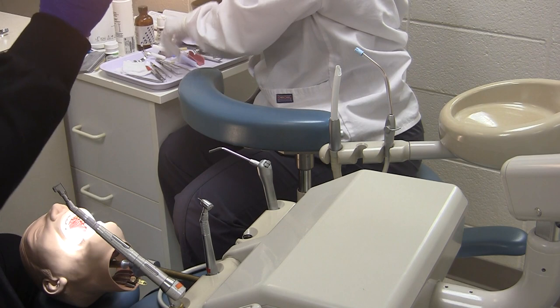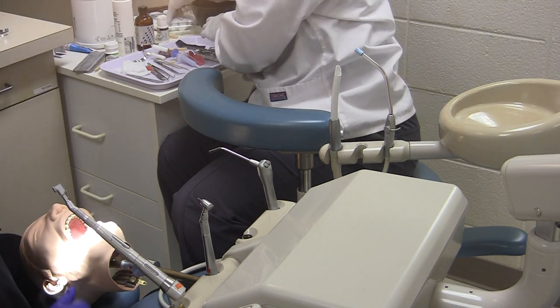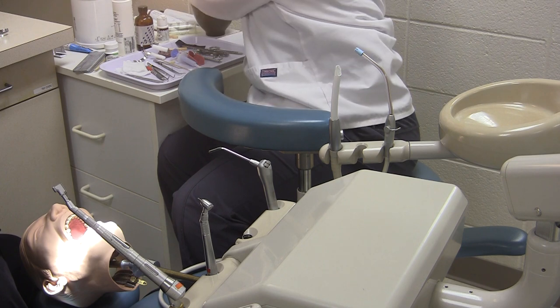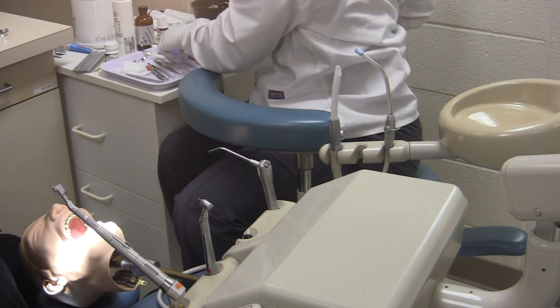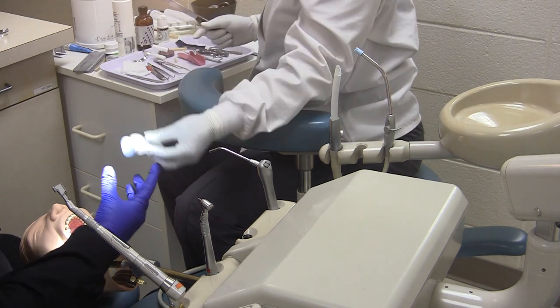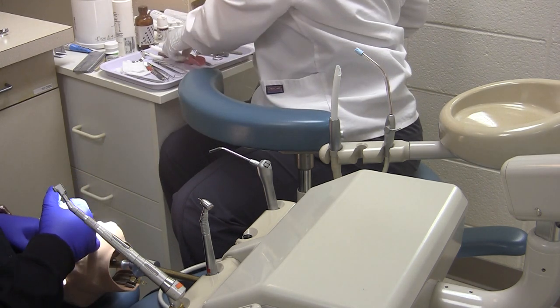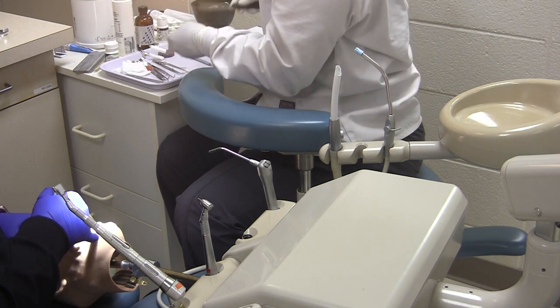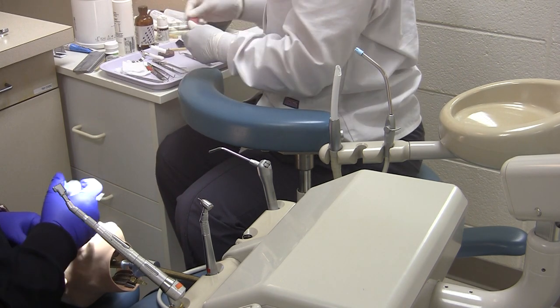Now the assistant is ready to mix the final impression material. In this case we are using Impregum. The assistant will load the syringe, pass it to the dentist, and then load the tray and pass it to the dentist.